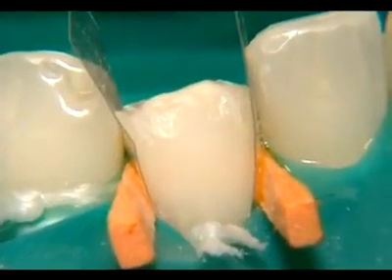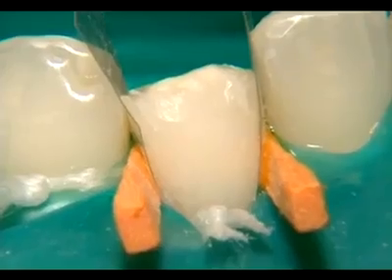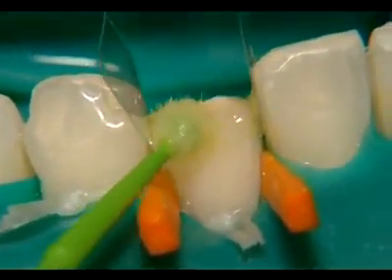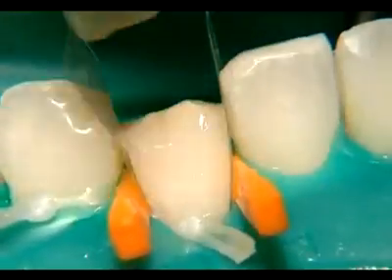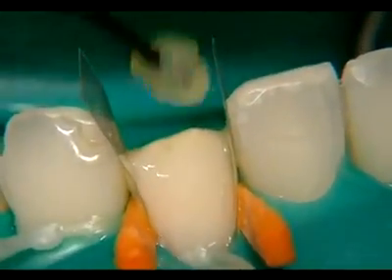After the preparation has been completed, translucent matrices are positioned at the proximal sides and wedged. A self-etching primer is applied to the dentin and enamel and allowed to react for 30 seconds. After that, the primer is thoroughly dispersed. Next, the bonding agent is applied, briefly dispersed and light cured.